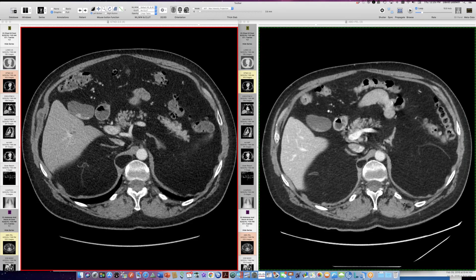Lipoma is the most common tumor of the diaphragm, but I've not seen very many cases. There aren't that many diaphragm tumors to begin with. Here's an example — an older abdominal CT from 2014 showing a lipoma in the pericrureal part of the diaphragm, and then a few years later in 2019, about five years later, the lipoma has gotten bigger. It's completely surrounded by some muscle — very thin here — so I don't think this is just a little herniation of abdominal fat into the fibers. I think this is really located solely within the muscle itself. So here's a diaphragm lipoma.